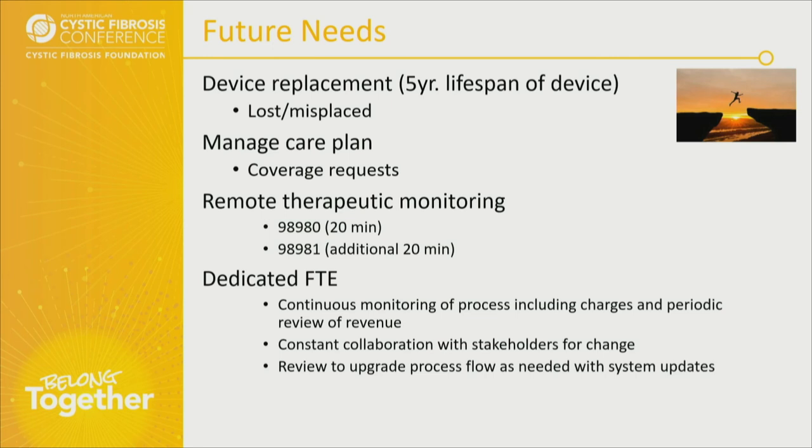Future needs. I do want to say that the lifespan of this device is only 5 years. We're already in year two. So we need to start planning ahead. And I've already had many people tell us that they have lost their device. You know, I think it was in my trunk. I moved since I got it. I don't know where it is. Reminding them, once you get it, don't lose it.